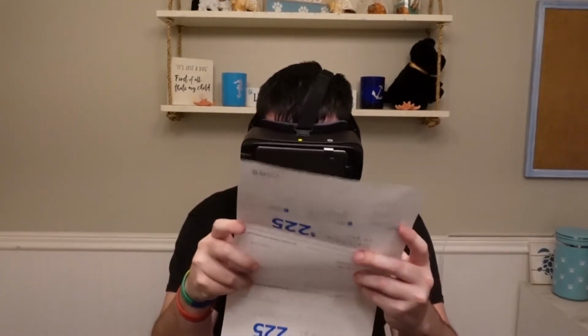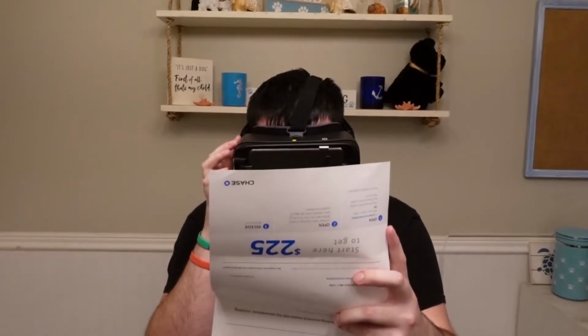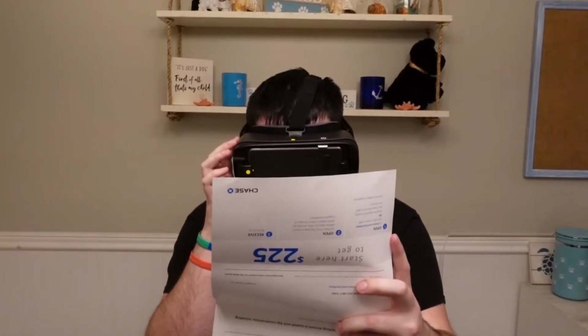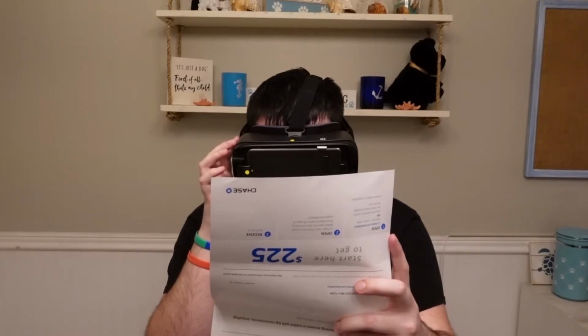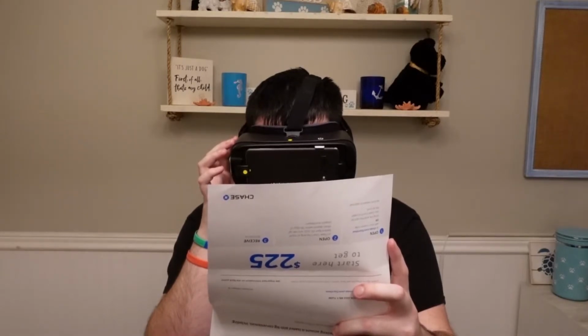Press the snapshot button to capture the text. Pause the readout by pressing the snapshot button once. Resume readout by pressing the snapshot button again. Starting online readout. 225p. 11840 QT. Finished readout. Text to speech speed set to normal.